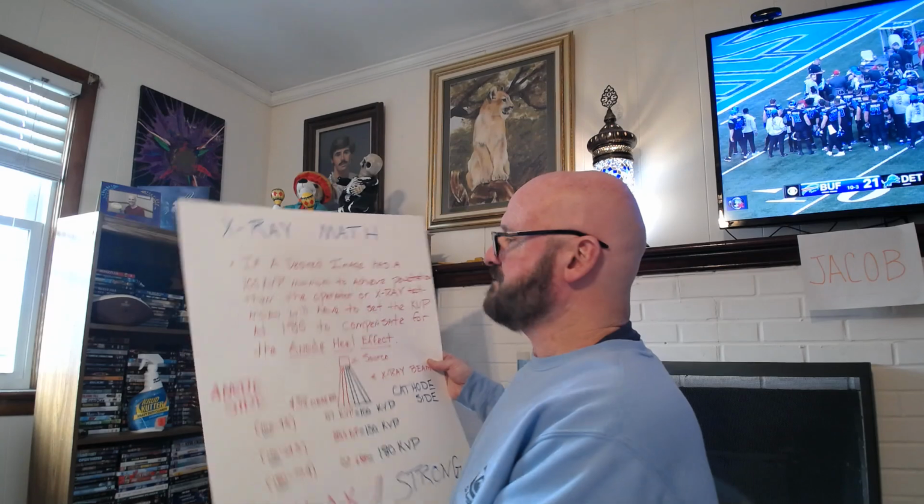Some of it is mechanical. Anode discs can erode over time, and they can pit, and that can increase the weakness. The other is that every X-ray beam is an action or a reaction to an action, and as such, it's unpredictable. So sometimes this particular beam is 20%, and this one's 45% weaker. But in any event, at the end of the day, it creates a math, okay?